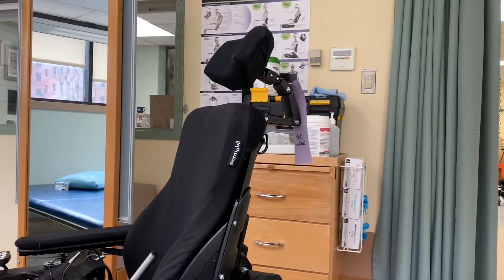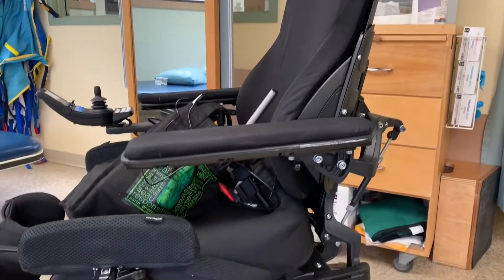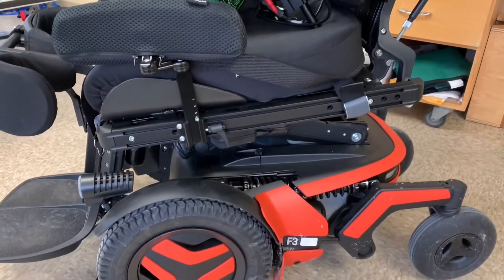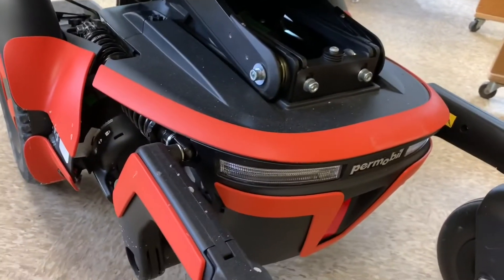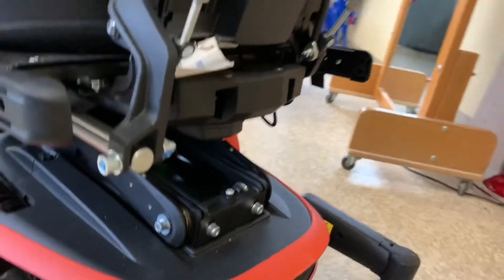Introducing the second generation Permobil F3. When I fill out the order form, I'm going to order this baby in a nice lime green. But yeah, this is not my chair — this is just a demo that's in for today for me to try out. Look how slick that thing is. So when I get in the chair, I'll show you some more details on the specs and what the controller is like.